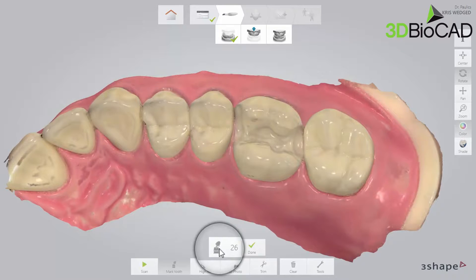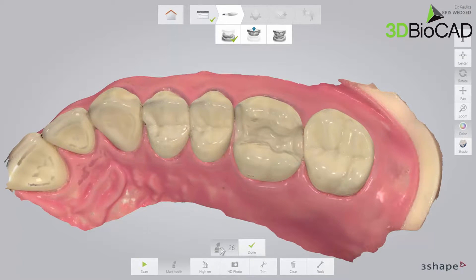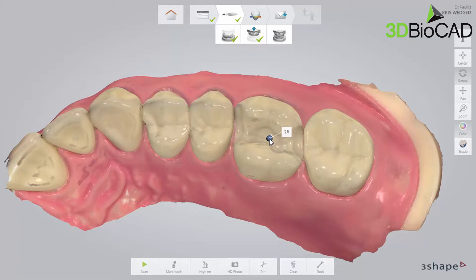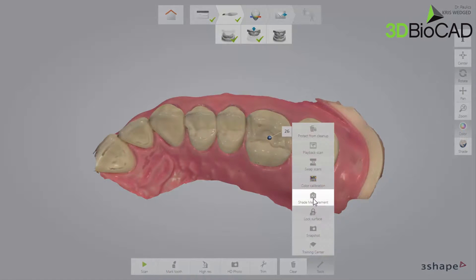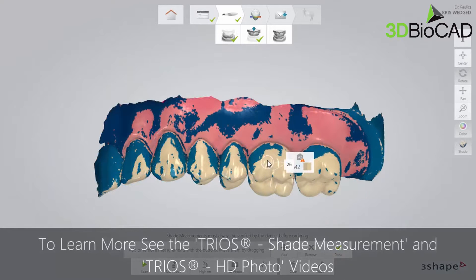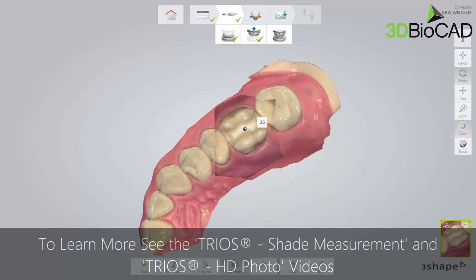Mark the preparation by clicking the centre of the preparation when seen from the occlusal view. A blue ball will appear on the preparation. Now you have the opportunity to take a shade measurement and an HD photo. Please see the TRIOS shade measurement and TRIOS HD photo videos for more information.